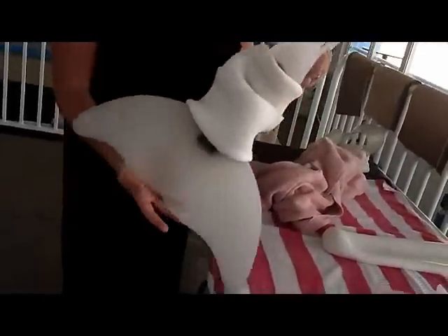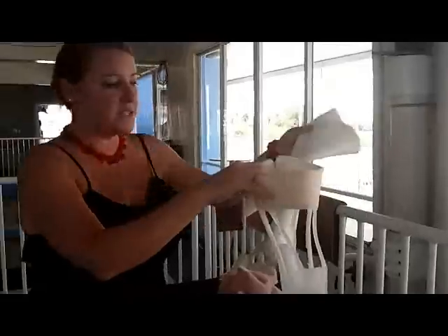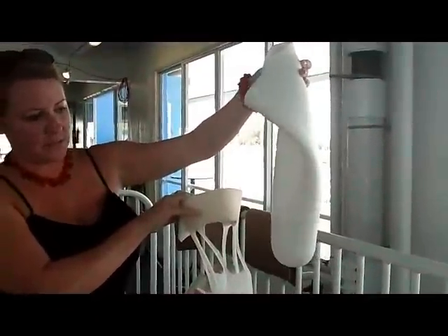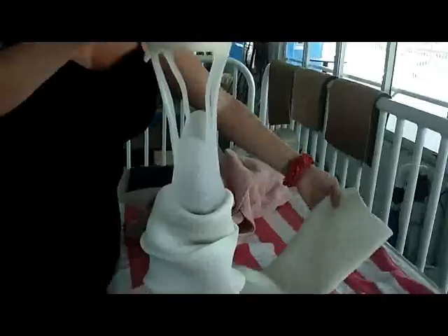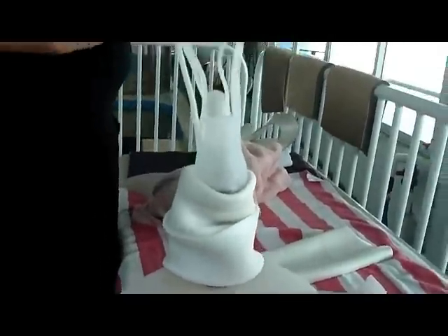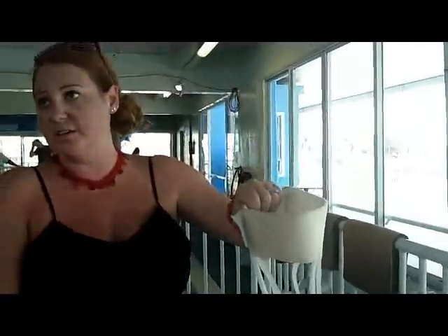This is actually the current tail right now, and the way it works is through suction. This piece rolls over down the back of her peduncle or stump, basically, and then that goes inside of here, and it's Velcro that wraps to this, and then this comes back over the top, and it's just suction that keeps the tail on.